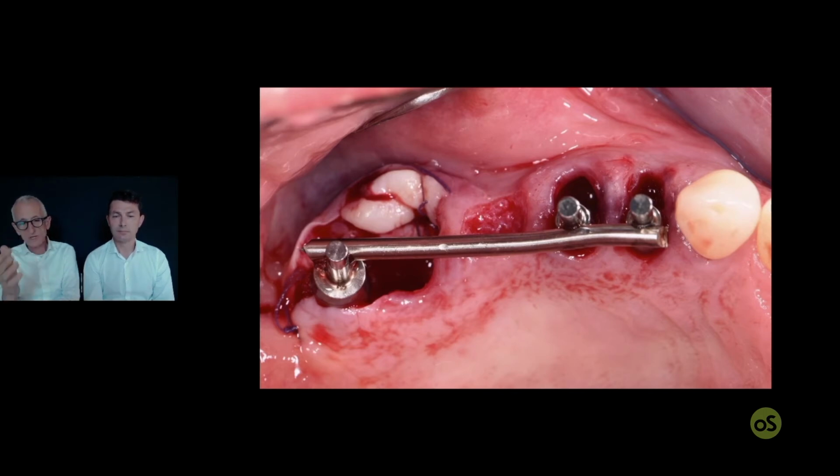And we are teaching you this technique because this is the technique that we have invented and that we are mastering, and because we think that this technique is really a great help. As you can imagine, in 20 seconds you have done a framework, and there is no other technique, no matter how expensive the equipment, that can provide you an extremely strong and durable framework in such a handful of seconds.